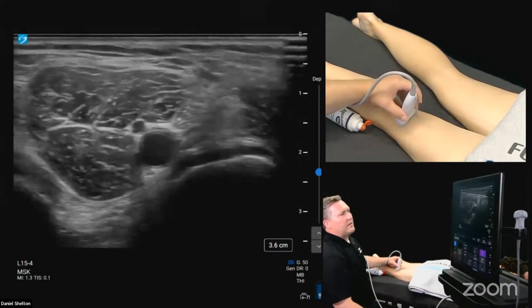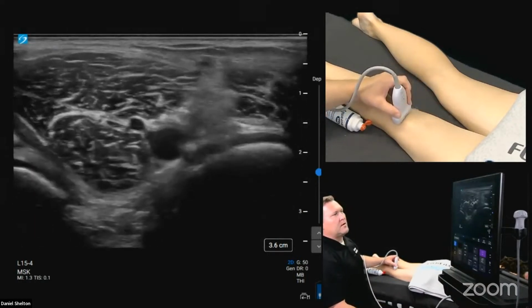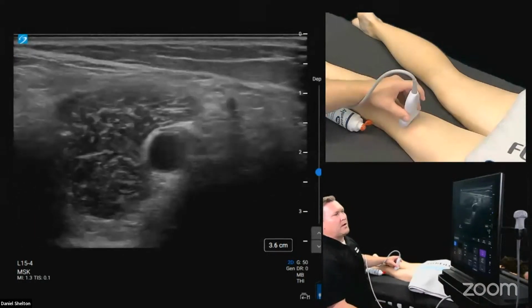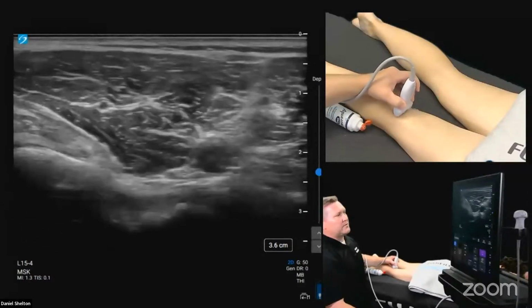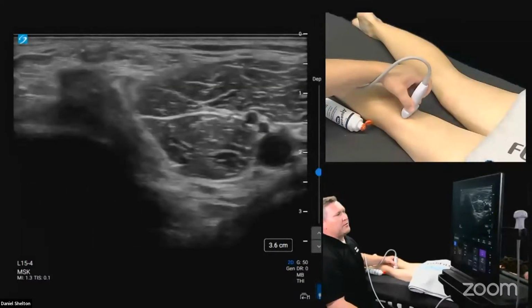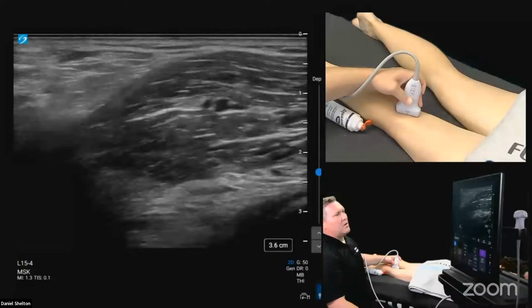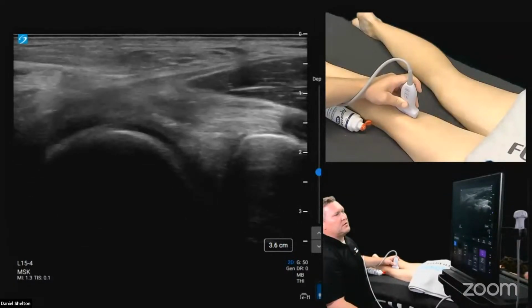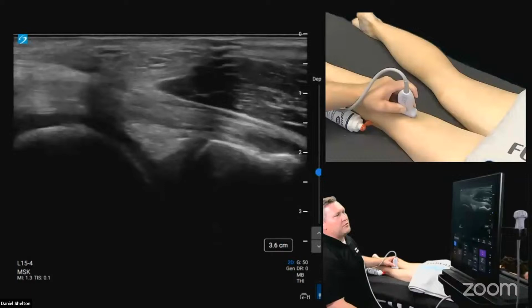So here we can see that sciatic nerve. Actually, we're going to get into that on the next set before we get too carried away scanning the cool stuff. Let's go ahead and go over those slides. But short axis, we've got semimembranosus, medial-headed gastrocnemius junction, that little bursa pocket there. Long axis, you can see the 2 crisscrossing each other. You can see beautiful, deep posterior joint anatomy.